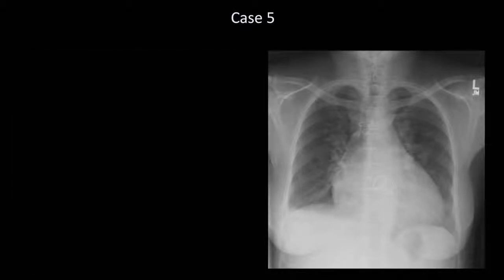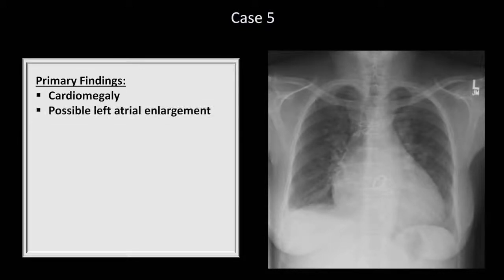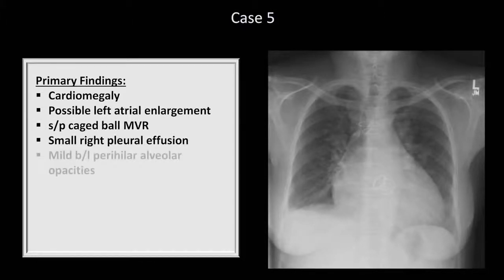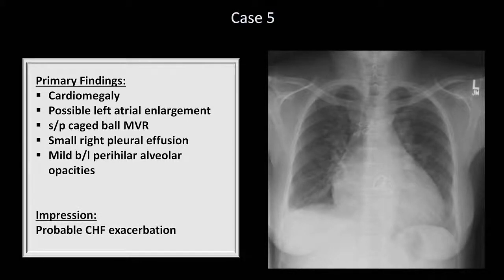Finally, two last subtle findings are mild blunting of the right costophrenic angle, suggesting a very small effusion, and there are debatably some perihilar alveolar opacities. So putting this all together, the primary findings are cardiomegaly, possible left atrial enlargement, a caged ball mechanical mitral valve replacement, a small right pleural effusion, and mild bilateral perihilar alveolar opacities. Considering the patient is presenting with one week of dyspnea and bilateral leg edema and has an elevated JVP on exam, the most likely explanation is a mild CHF exacerbation. Although caged ball valves are extremely durable with essentially 0% rate of mechanical failure, they can develop blood clots and deformations of the ball, leading to mitral regurgitation.